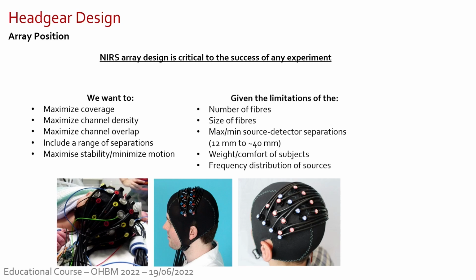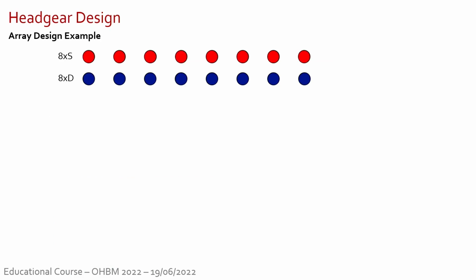Of course, we have a limited number of fibers. There's a minimum and a maximum of source-detector separation. It's very important to think about the comfort of the subject, again, because you want the participants to be quite comfortable, right, with a hat on.